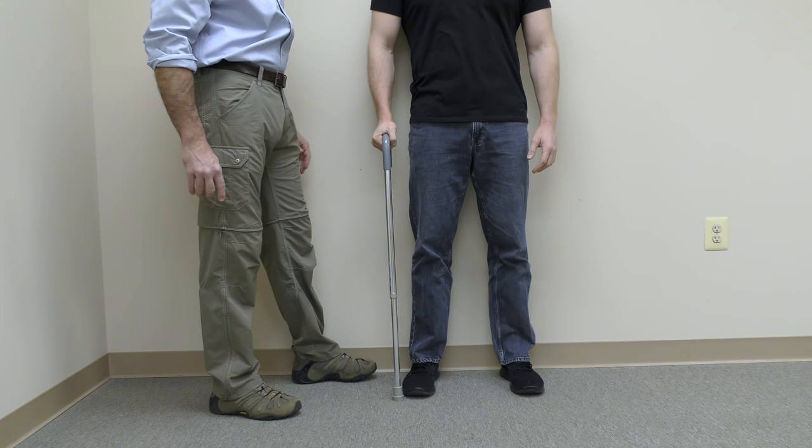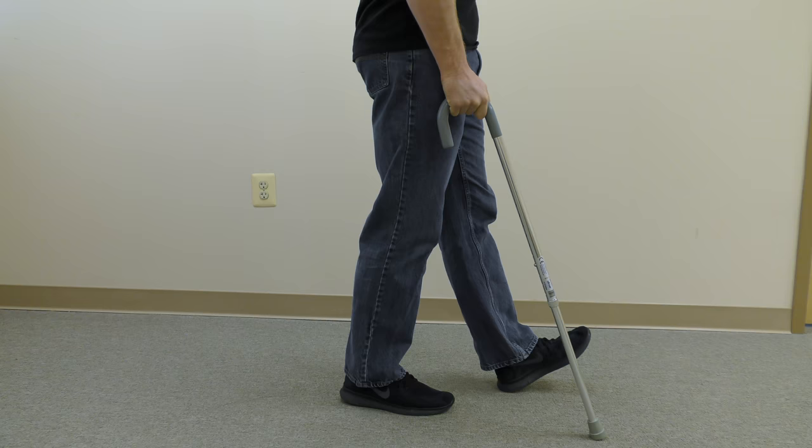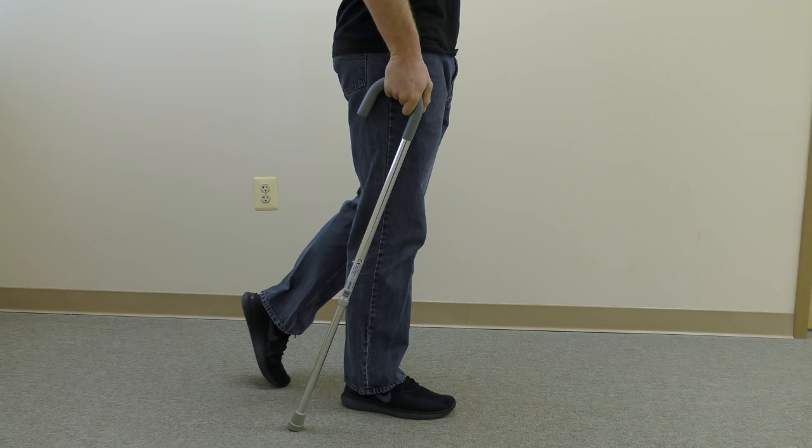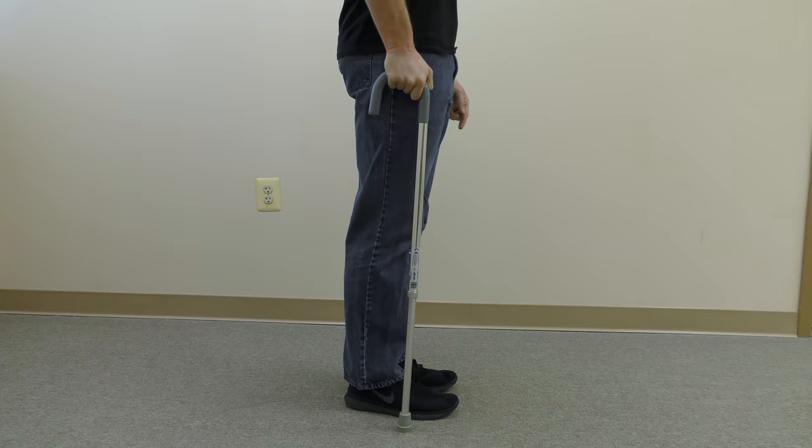The optimal way to use a cane is to place it in the opposite hand of the weak or involved side. In this case, his left lower extremity is involved. To practice the correct pattern, stand still and move the cane and the involved side together. When you dance, you move with your partner — the cane and the involved side are partners, so they always have to move together.